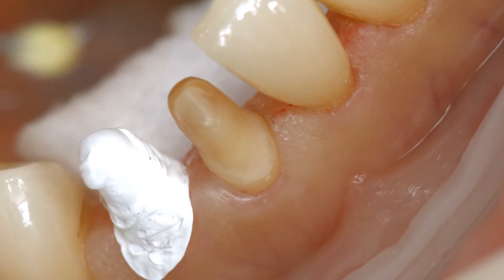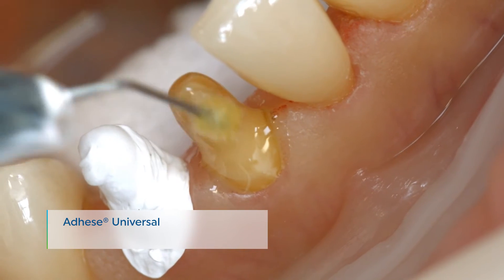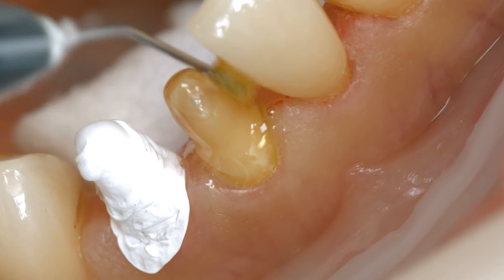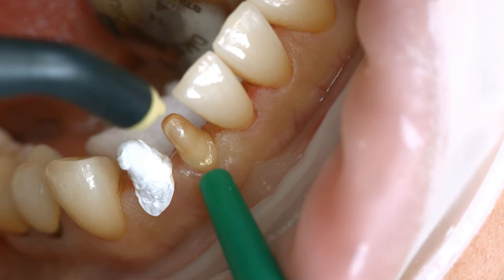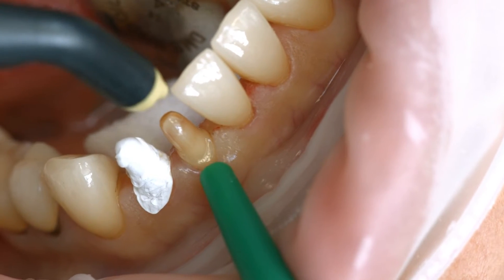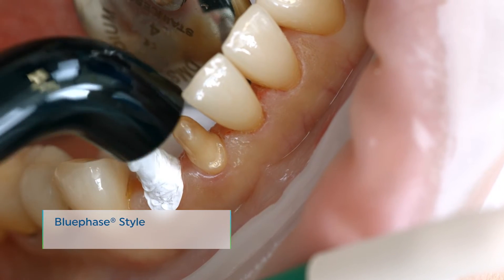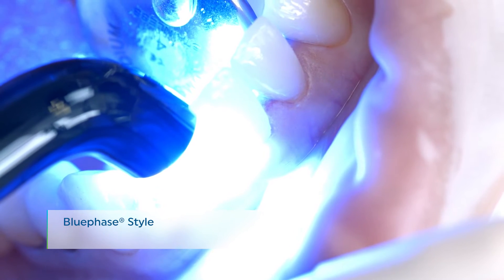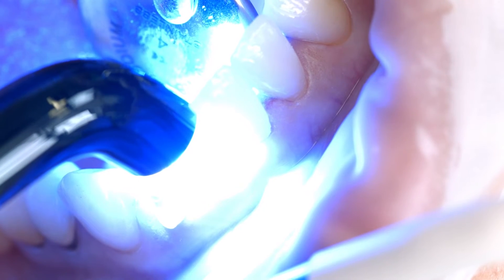Coat the entire bonding surface with Adhese Universal and scrub the adhesive in for 20 seconds, starting the procedure with the enamel surfaces. Disperse excess amounts of Adhese Universal with a stream of air until the mobile liquid film has disappeared, making sure to avoid pooling. Light cure Adhese Universal for 10 seconds using a curing light with a light intensity of at least 500 mW per square centimeter, for example blue phase style.